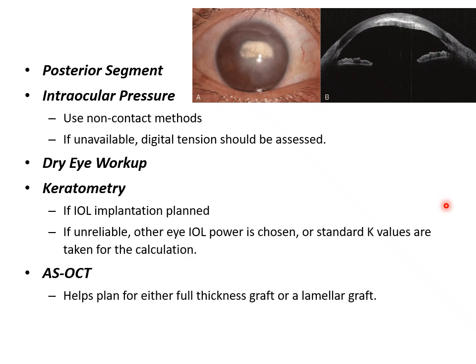Dry eye workup is desirable, not absolutely mandatory. Keratometry, yes, keratometry is a must if IOL implantation is planned. And if the keratometry is unreliable, again, because of the scar, you may not be able to see the mires properly, then in that case, you can use the IOL power of the other eye, or you can just input the standard K values into the machine and use them for calculating the IOL power.